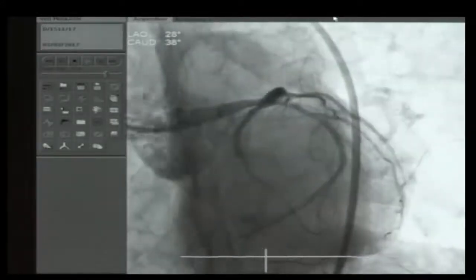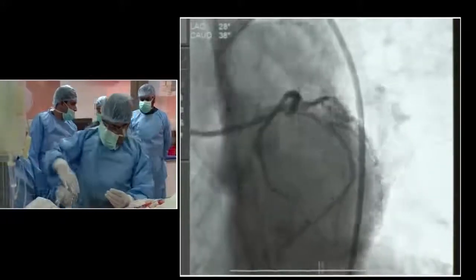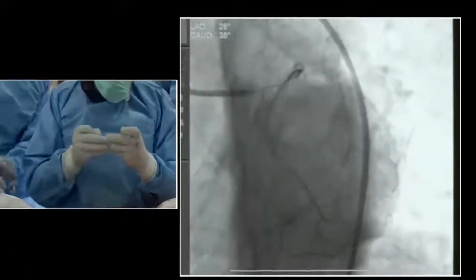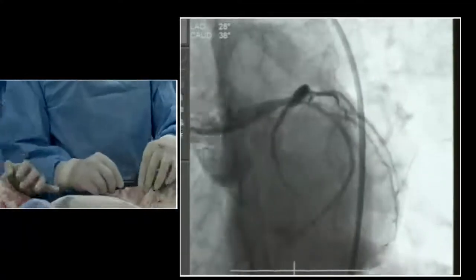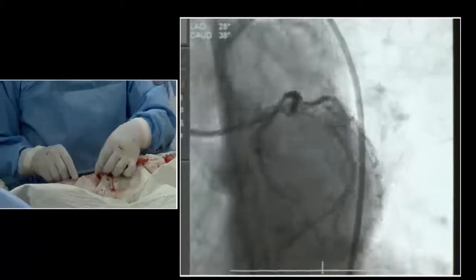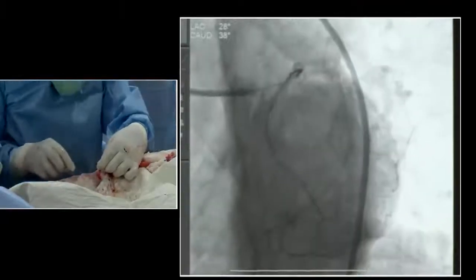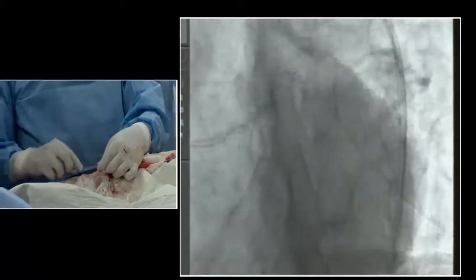Quickly, because time is going quickly. Take it out quickly. What is the length of disease in the IVUS in the circumflex? So we are taking it. Prepare. Hold it. So you have decided mini crush or DK crush, sir? Put the second one over it. I'll go for a so-called mini or micro crush. Try to have as little crush as possible. Give me the stent.